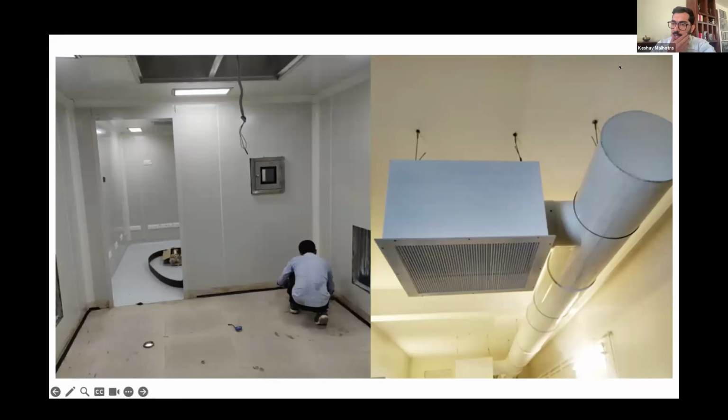I'll pick your brain now with certain images, Charmaine. I have a comparative image here where on the left side, you can see that the HVAC is probably going to get installed into the ceiling itself. On the other side, you have this vent that goes through the laboratory and the OT, because this is probably something that they did later on.